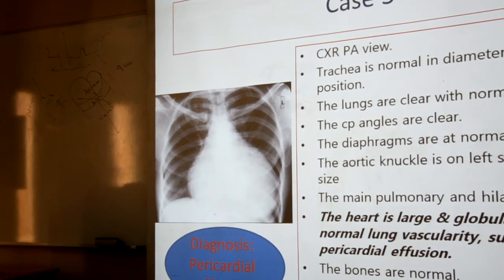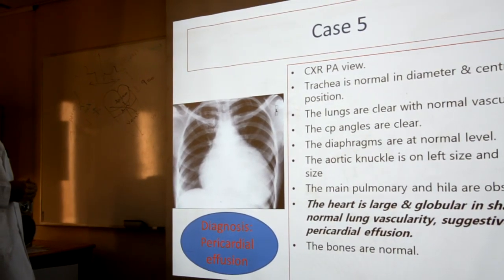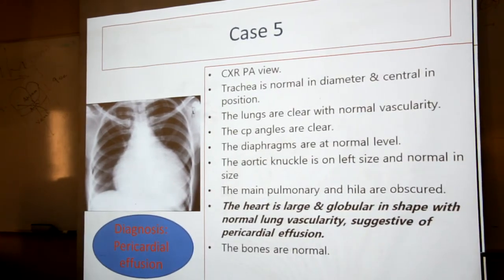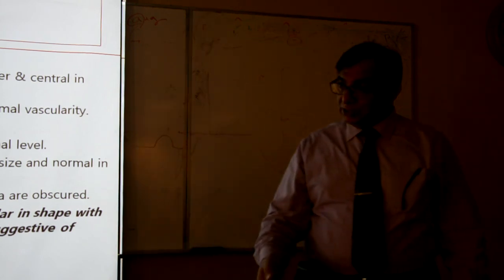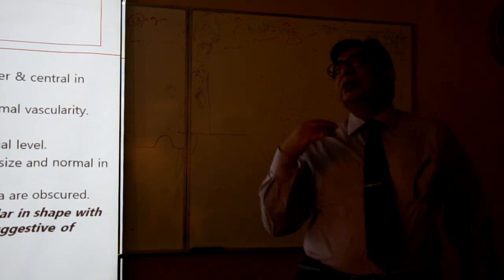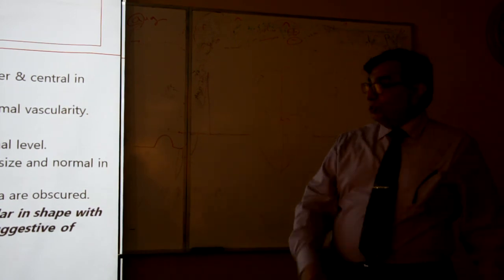Say whatever is genuinely in front of you. In every X-ray, everything is not revealed. But you go through the checklist; the marks are for the checklist. Because we understand in the exam that you know the checklist and you are following it. It means that you know the subject. If you don't say it, I will understand you do not know. Remember, this is a very important message to you.